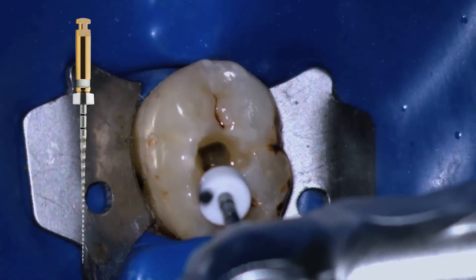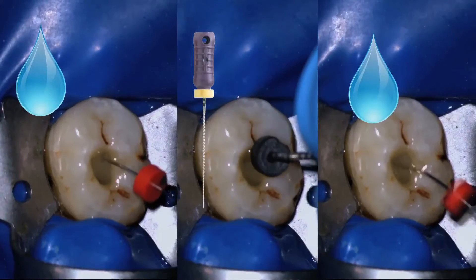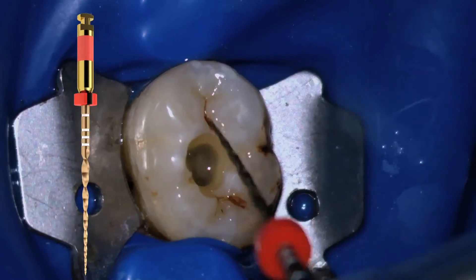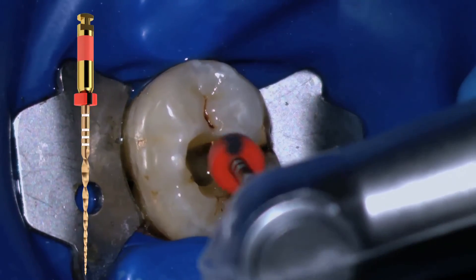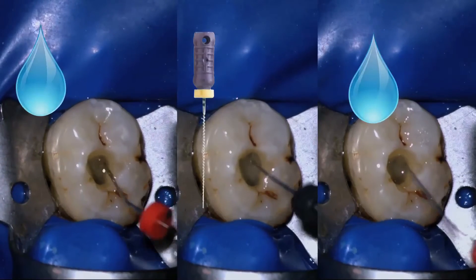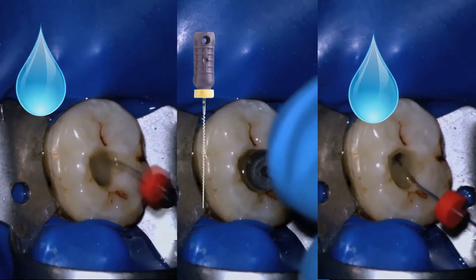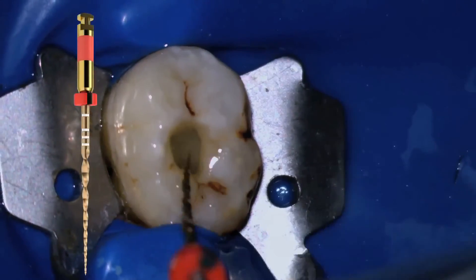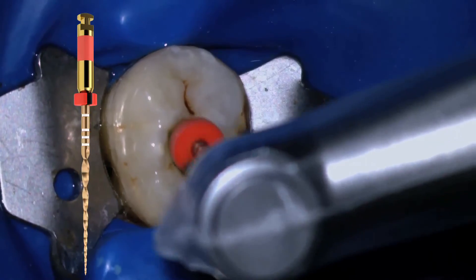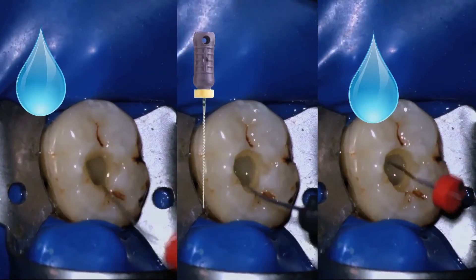With the ProGlider rotary instrument, we go little by little in amplitude strokes of three millimeters, all the way to working length — sometimes it takes several steps. After that we irrigate and verify the canals are still patent, making sure we have not blocked ourselves. Then we use WaveOne Gold in amplitude strokes of three millimeters. We can see irrigation on the left and, in the center, we are confirming the canal is still patent. After each file removal, more irrigation is required. We continue with WaveOne Gold for the second pass, preparing the middle of the canal.